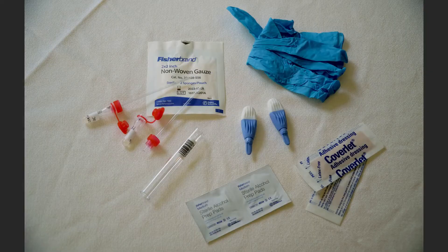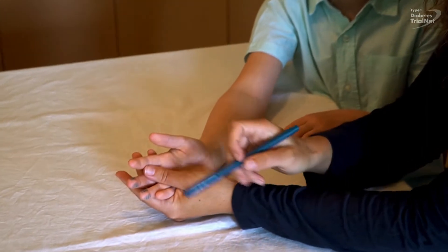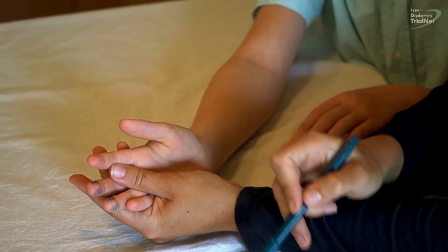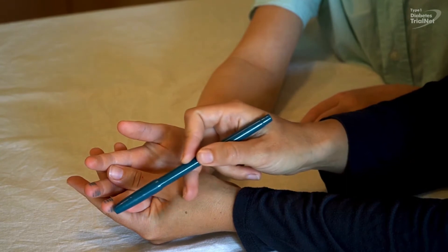Your first step is to lay out the blood draw supplies. The participant should be seated comfortably. Choose a finger stick site in one of the shaded areas as shown. Typically, the best place is the middle finger or the ring finger, just off the center of the finger pad.